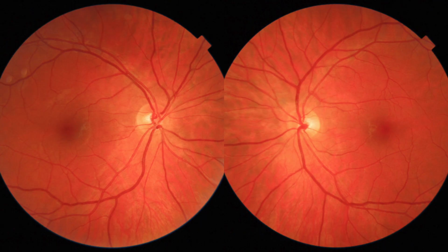So when you get right and left lined up with one another, this is as if I'm staring directly at you. This is what my retinas look like, with the right retina, the optic nerve, looking a little bit as if you're viewing it. It should be to your right, kind of towards where my nose is a little bit. And the left optic nerve being a little bit to the left, kind of towards where my nose is. But that's the position of what the anatomical structure of the human eyes look like.